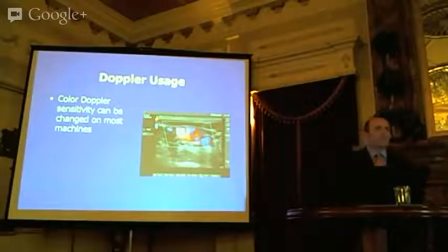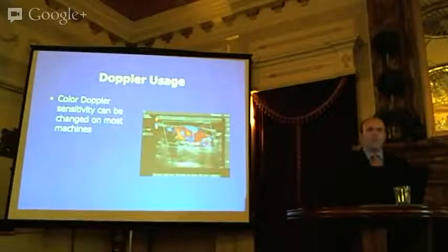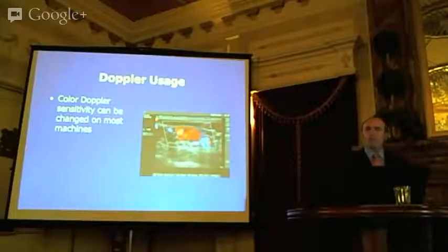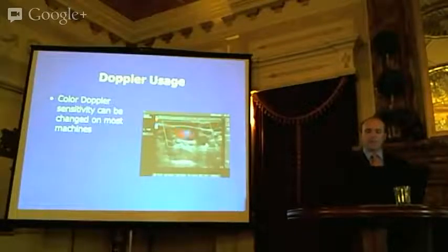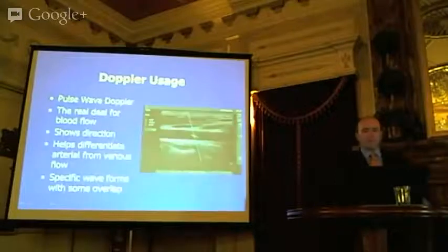Also, you have to be careful about the sensitivity on your machine. How is it set? When you fire up a machine, depending on who's used it before, unless it automatically goes back to a preset, it's very much like a box of chocolates. You really don't know what you're going to get, which probe is going to pop up, what the settings are going to be. So depending on the settings, you can have your flow decrease to almost no flow within a vessel. This carotid is not occluded. We just changed the Doppler sensitivity, so we're still getting some flow in this IJ. Do I assume that this is the vessel, this is the vein, this is the artery? It can be very confusing initially if you're brand new to ultrasound, so be careful.